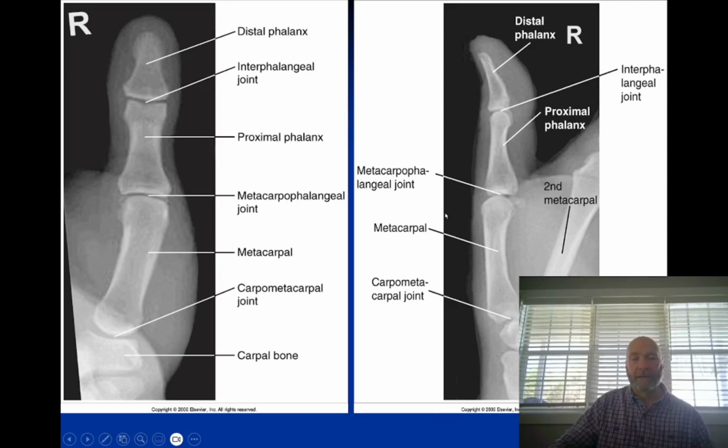We used to do that all the time in screen film radiography. In DR systems, you just can't do that. As soon as you make your exposure, it comes up on the image receptor. So a couple of things about that. One is that if you're putting two on one on a CR cassette, the CR readers sometimes can be kind of particular in their recognition of your collimated field. So what you might want to do is position them more towards the inside of the cassette and make sure you've got four good borders of collimation on both of those images.